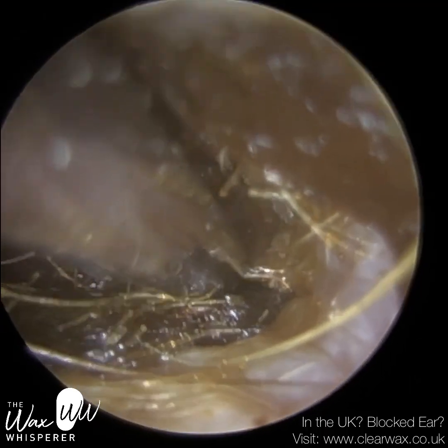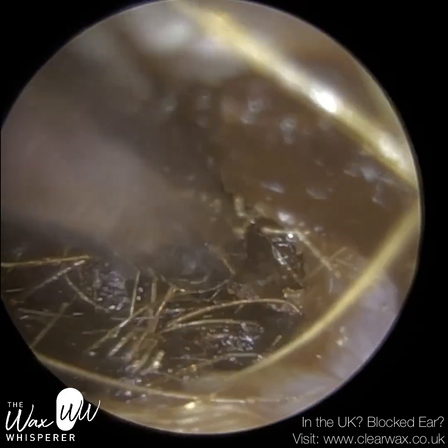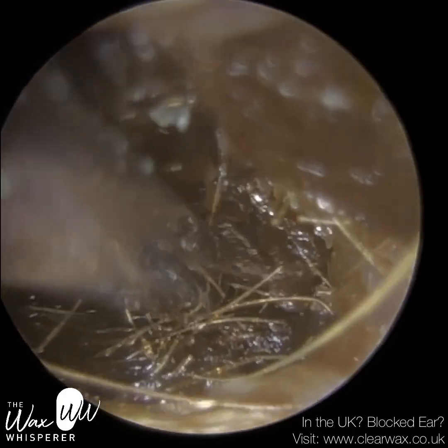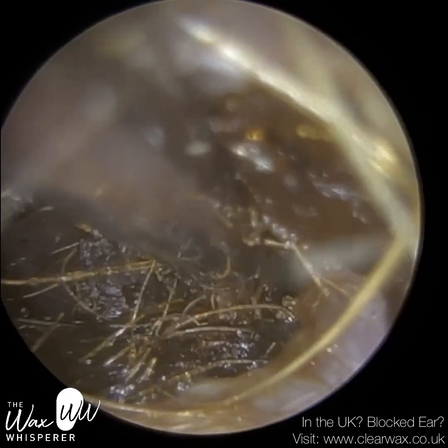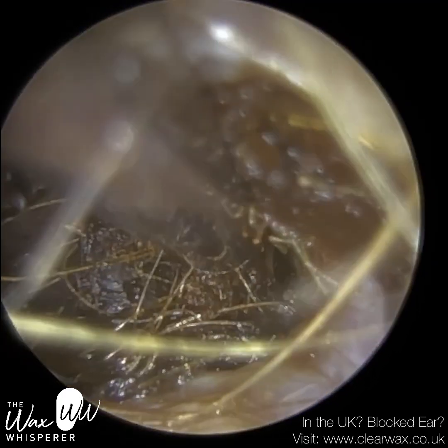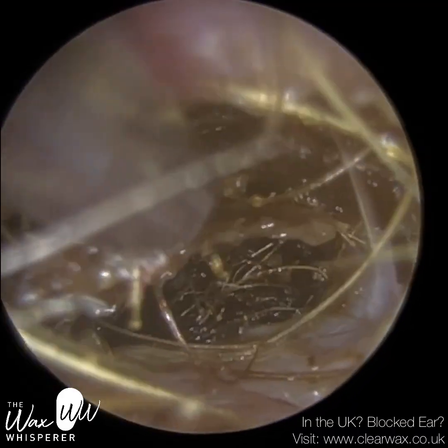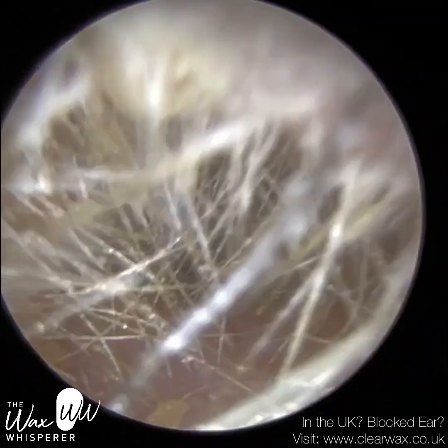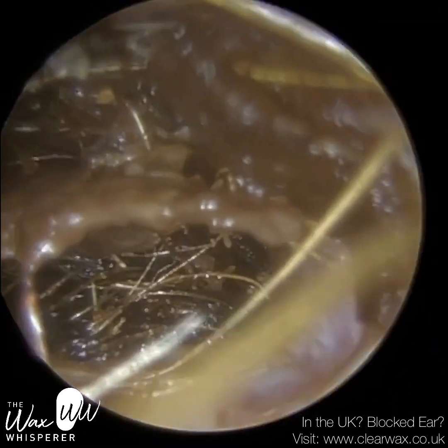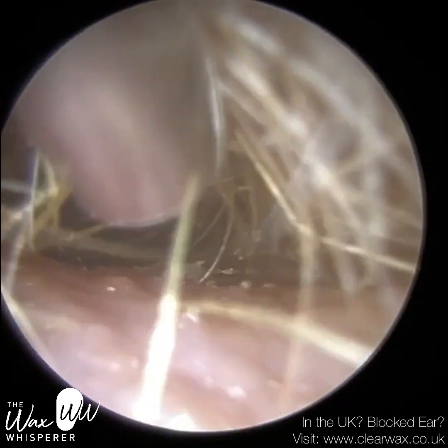So similar to the right ear, the patient had been using a Q-tip here, and it's really squashed this wax right up against the eardrum. So we're now working on the final, probably fifth of the ear canal, so around 2 centimetres in, so we've got half a centimetre to play with. I can just about see the eardrum in the distance on the left-hand side. Around 10 o'clock, there's a little opening there. So it's just this last residual amount, but this is the part that's really causing the patient problems.